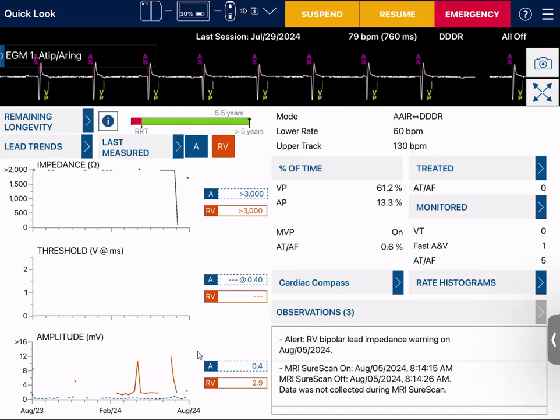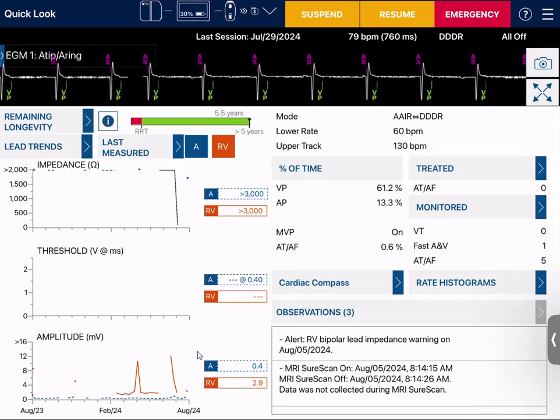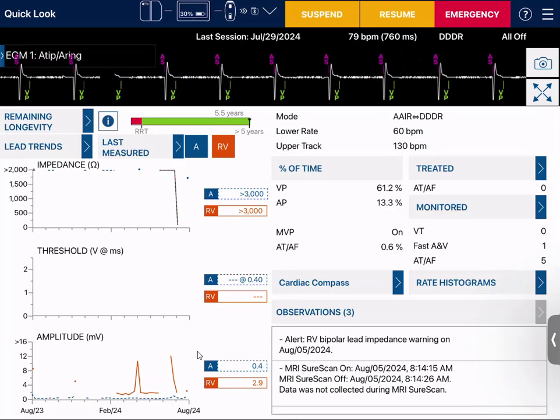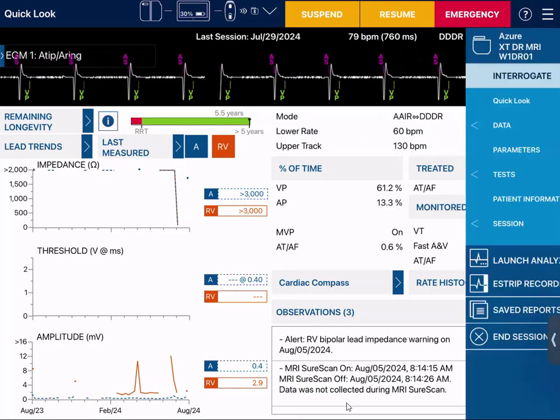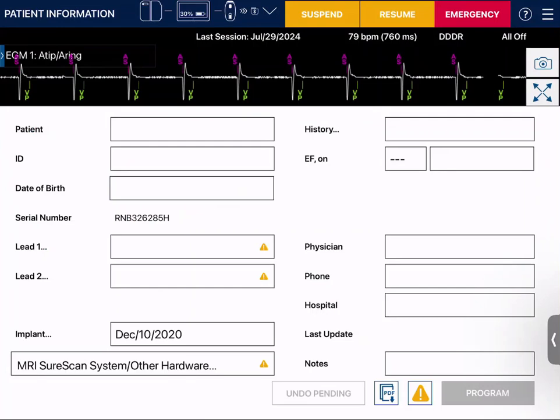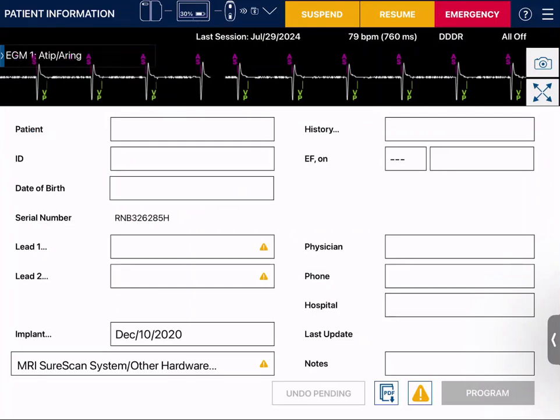We're going to look at the pacing percentages for this patient. The percentages are A-paced 13.3% and V-paced 61.2%. We'll click the chevron to look at our patient information and see if there's any information in there that helps us understand what's going on with the device.